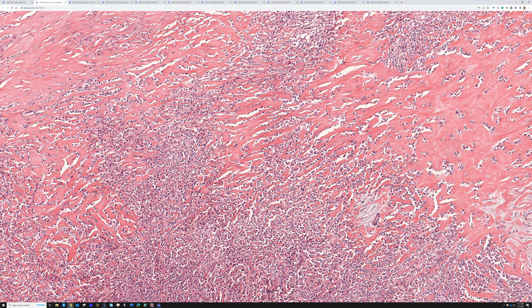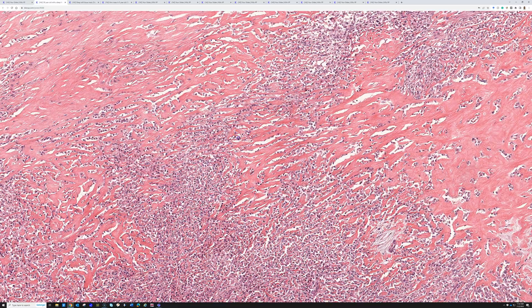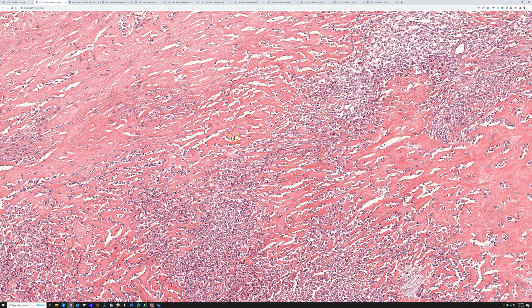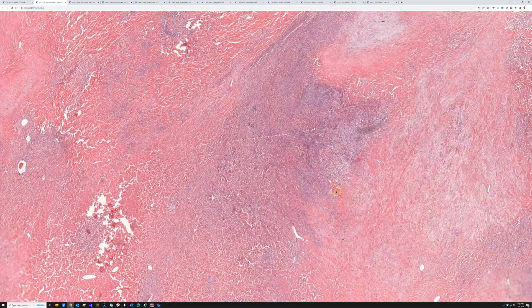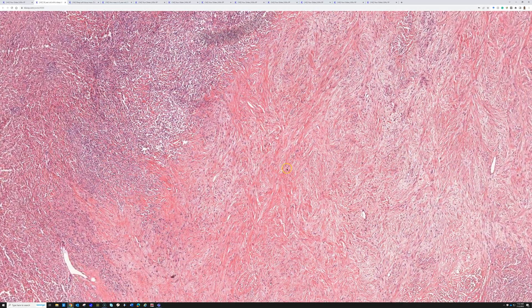This entity is called sclerosing epithelioid fibrosarcoma. It's an interesting and quite rare tumor. It has some degree of overlap or relationship to low-grade fibromyxoid sarcoma, also known as Evans tumor. In some cases you have areas of bland spindle cells resembling low-grade fibromyxoid sarcoma that are hybrid and merged with the more classic sclerosing epithelioid fibrosarcoma pattern.